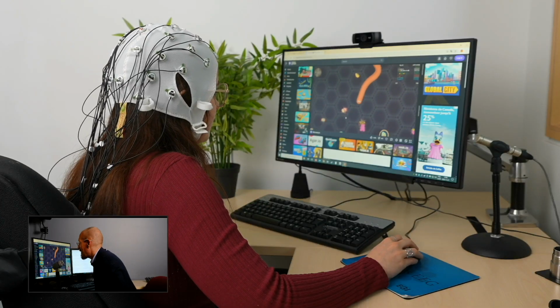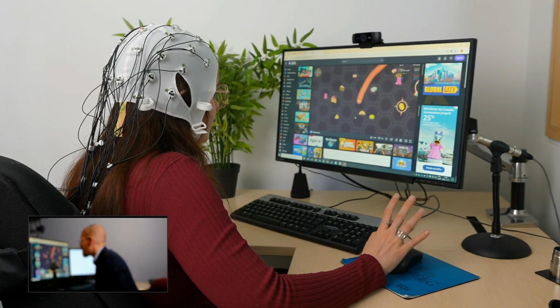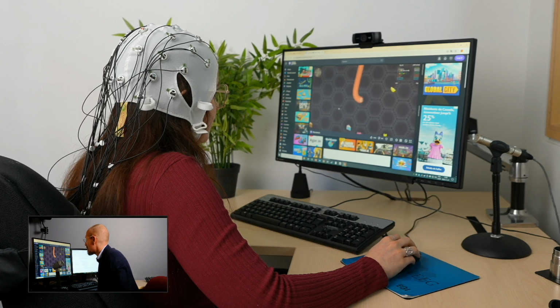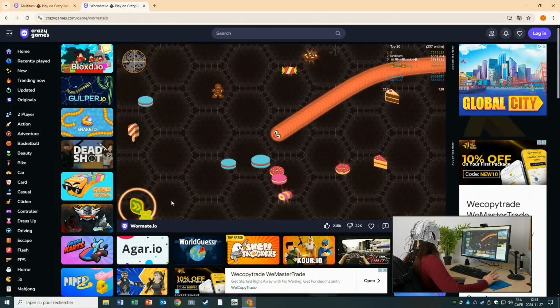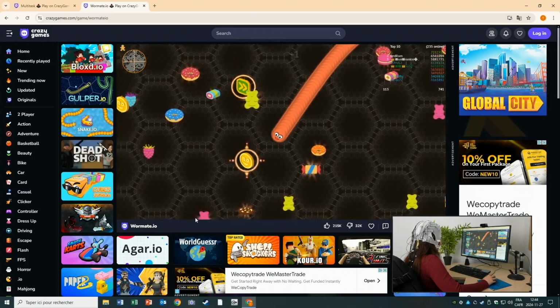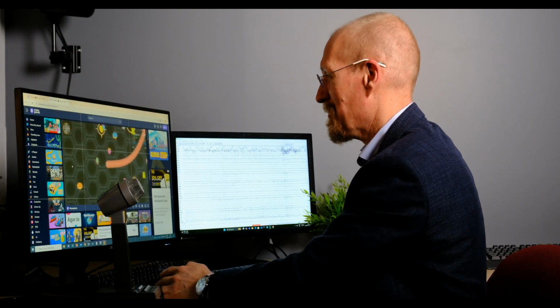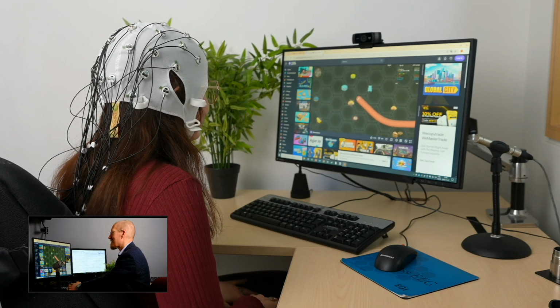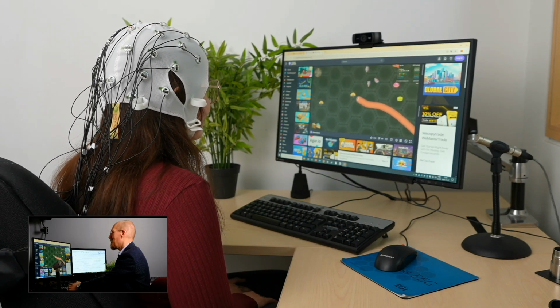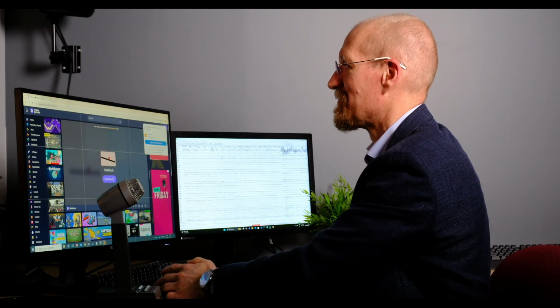And you can go ahead and stop, or you can find another worm to kill yourself. If you can't, I'm just going to end it for you. Yeah. Okay, good job. All right. So we'll close that and move on to our next task.